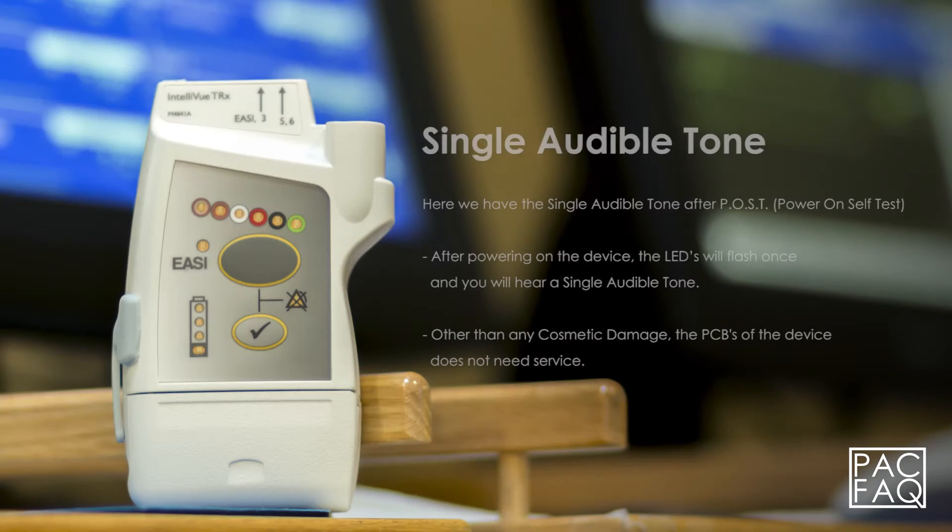Here we have the single audible tone after POST, power on self test. After powering on the device, the LEDs will flash once and you will hear a single audible tone. Other than any cosmetic damage, the PCBs of the device does not need service.